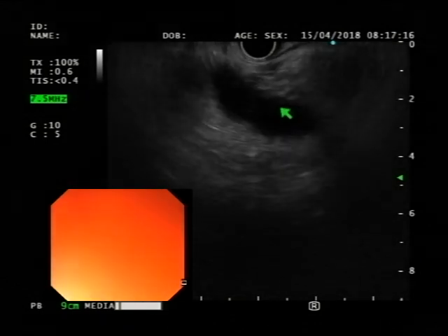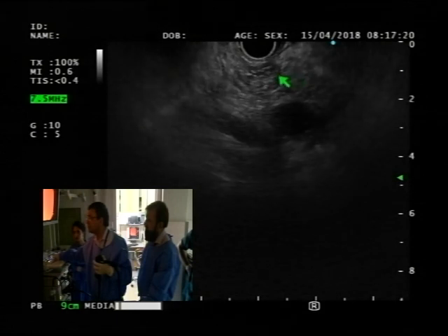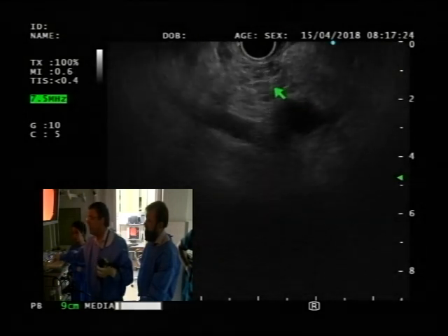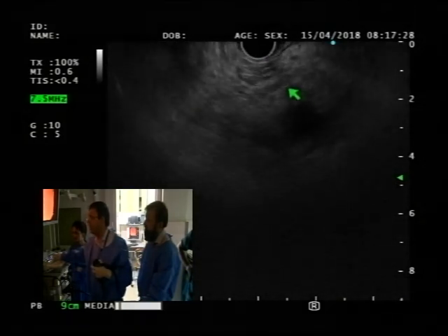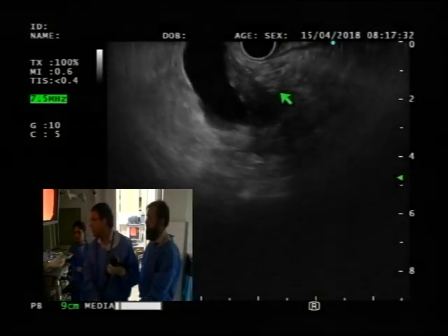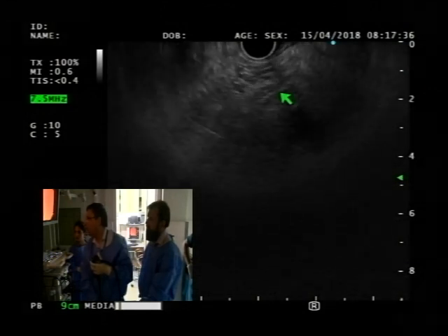Yeah. You don't even see much of the pancreatic tissue. Here, you see some features of chronic pancreatitis. You see that right there. Looks like a Swiss cheese. Yeah. Like there are some foci, strands, some lobulation there. The pancreas is extremely atrophic looking, but there's no ductal dilation really of the pancreatic duct or even the bile duct.